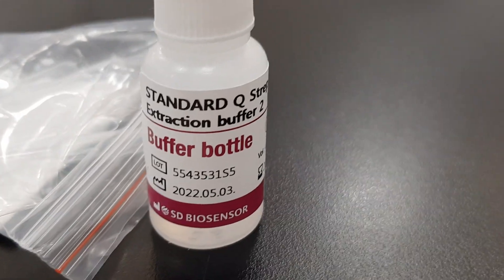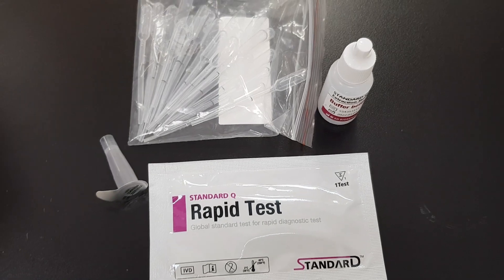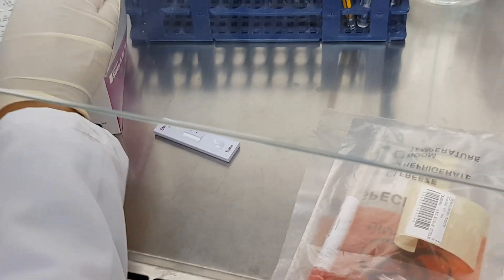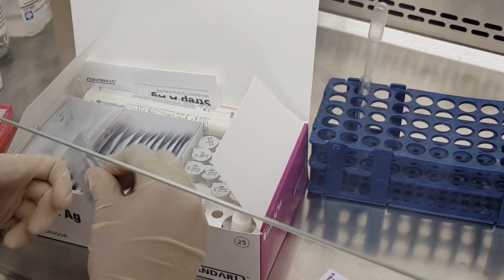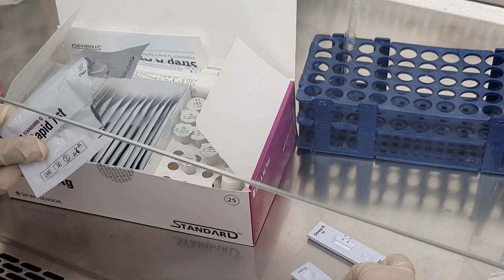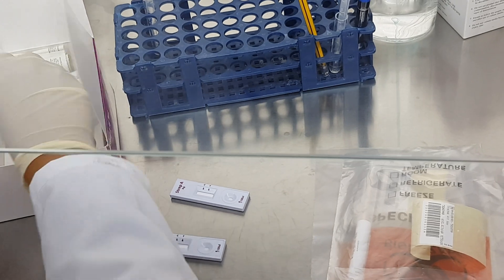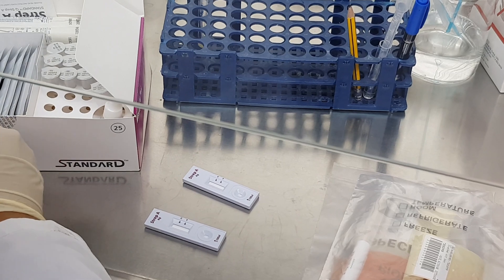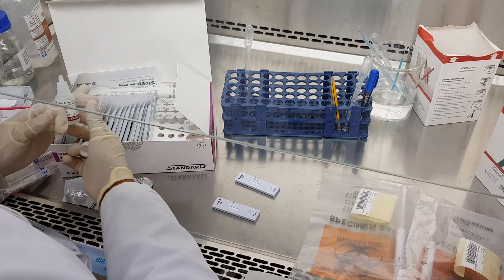In this procedure, we're using the standard Q Strep A antigen rapid test that detects group A streptococcal antigens. This simple procedure generally involves mixing a buffer directly with the patient's throat swab and pipetting the mixture into a sample well on a test card, which will be read after 10 to 15 minutes.